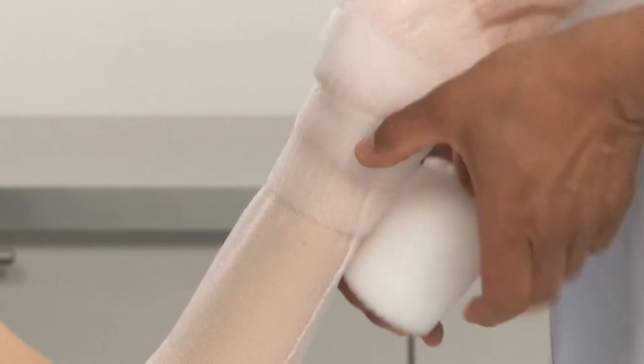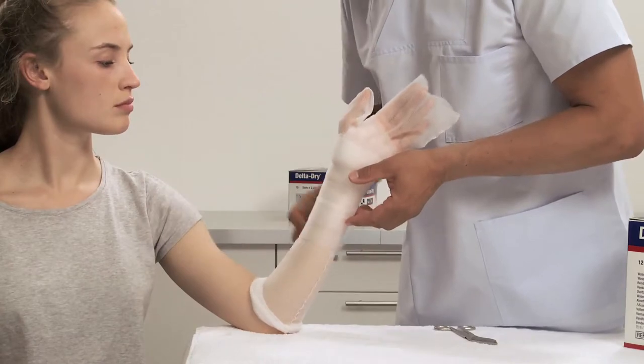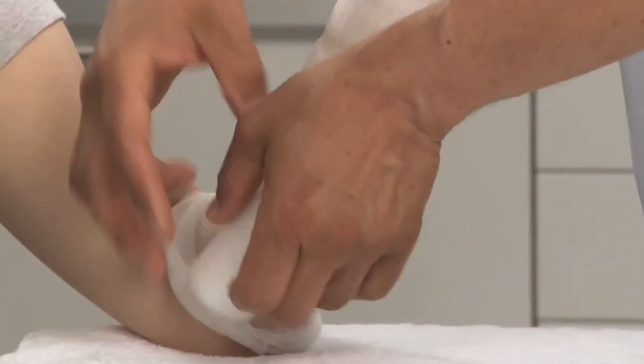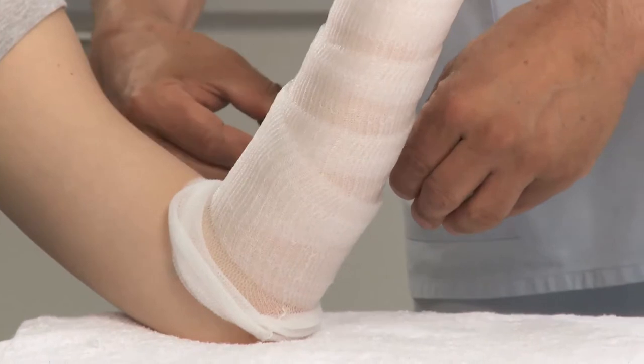If additional padding is required over bony prominences, it's preferable to apply a piece cut from the roll and place the adhesive side down on top of the two layers. Extend the padding 2.5 cm or 1 inch beyond the desired edge of the cast, but not beyond the stockinette.